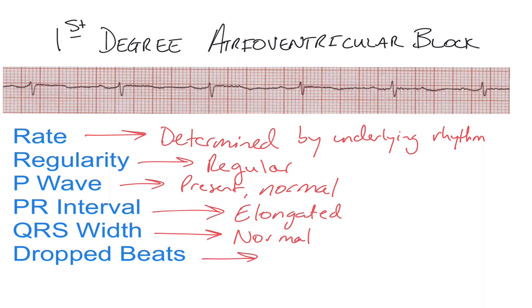There are no dropped beats with a first-degree AV block. If we look up here, we can see a P wave just before this dark line, and the QRS starts roughly five boxes later. So an elongated PR interval is one that is 0.2 seconds or more.